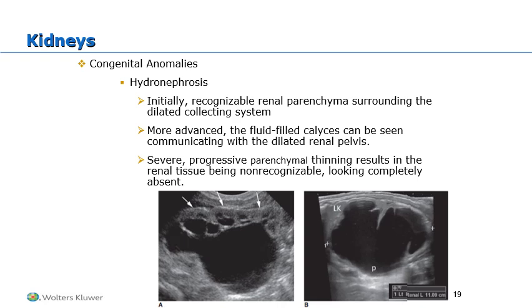So here in this image, we see a severe case of hydronephrosis, to the point where the renal parenchyma is being so compressed that ultimately it's probably going to stop functioning. It's going to start thinning, as you can see, especially in this right example, very thin cortex, and we know that's where all of the action takes place in that urine production.